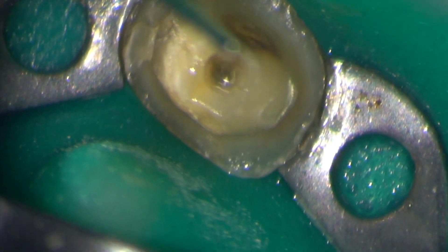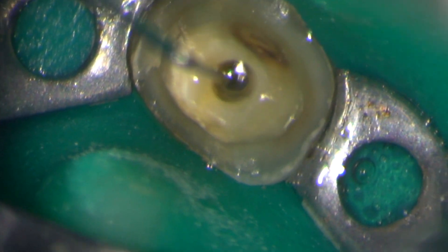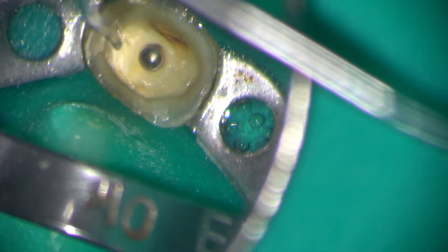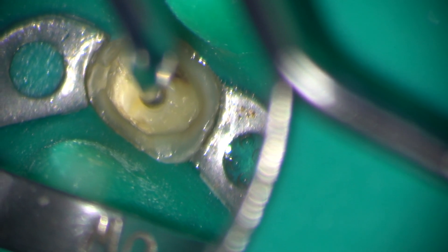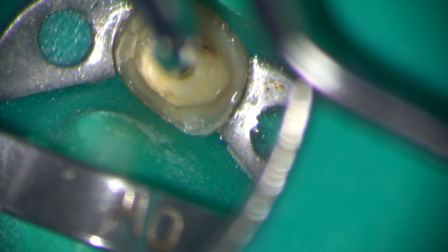There we are. I can now see that the tip of the instrument is loose and I'm going in one final time with my fine ultrasonic tip to vibrate the lateral aspect, and satisfyingly the file rotates and flies out of the root canal.